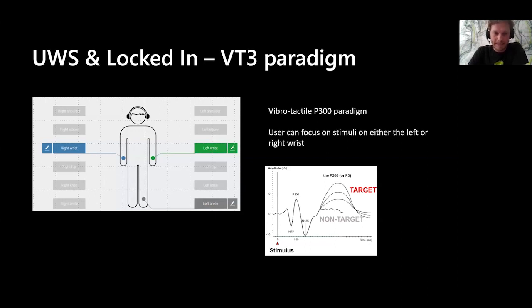One thing is if the patient is able to understand and to answer the question at all. If you're not able to detect the P300 wave at all, then the patient might be sleeping. Sometimes you don't notice that, or the patient is too impaired to understand or answer the question. So this is the first level of interpretation.